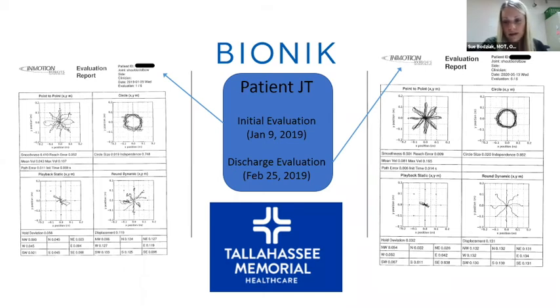It was a really big jump in his improvement, but it did take a little bit longer, maybe due to his age and the severity of his stroke. Even after a year, this is really good data to show how much improvement you can get. He is now hunting and taking care of his dogs, all with adaptive equipment, but the robotic arm definitely helped his mobility with that.